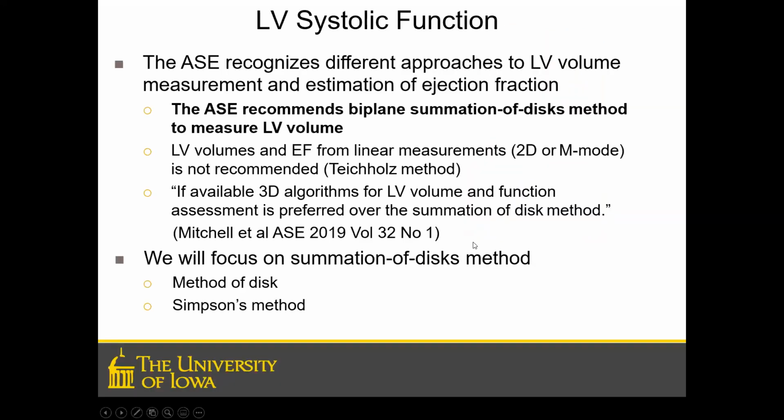All right, the ASE recognizes different approaches to LV volume and estimate of ejection fraction. They recommend biplane summation of disc for volumes. Those are better than, again, our linear measurements. And if available, 3D algorithms for LV volume and function are preferred over method of disc.